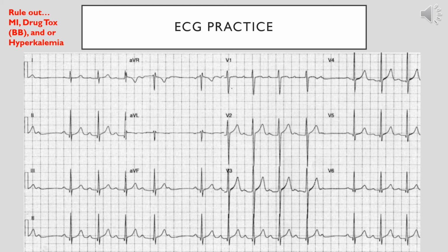As we are looking at the strip at the bottom, we see a normal PR interval after the first dropped beat, then a longer PR interval, an even longer PR interval, an even longer PR interval, until it's dropped. So when we think longer, longer, drop, then we get a Wenckebach block. So this is an AV block, second degree Mobitz 1, or Wenckebach block.